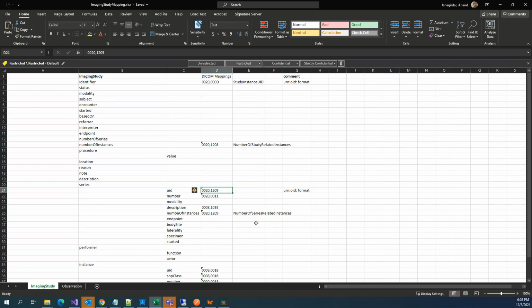That's the main thing I wanted to share. Just wanted to see if there is anything else you want me to go through. I can go through it. I have one question. Anand? Yeah, Hemant. Hi, Hemant.